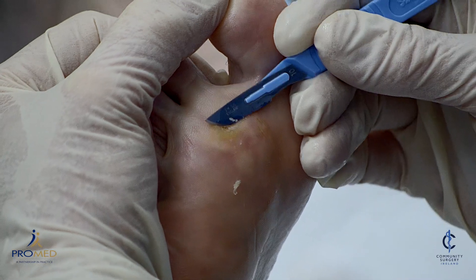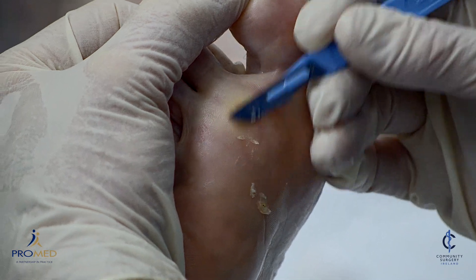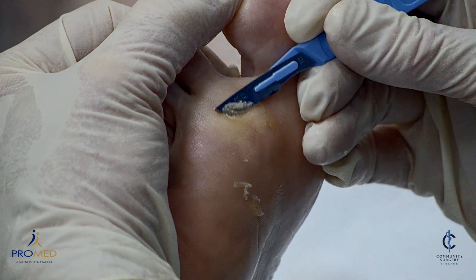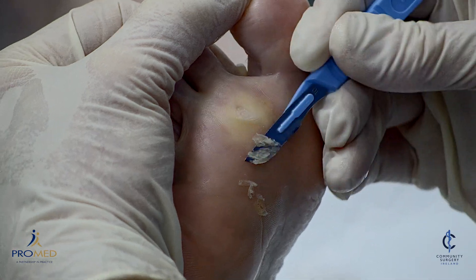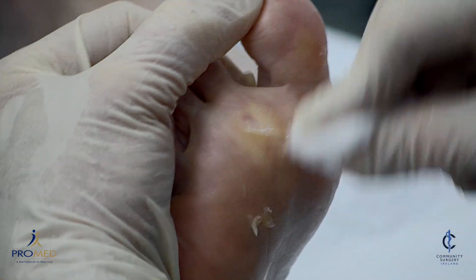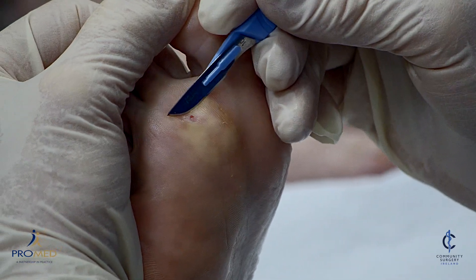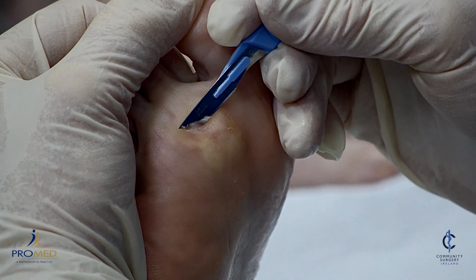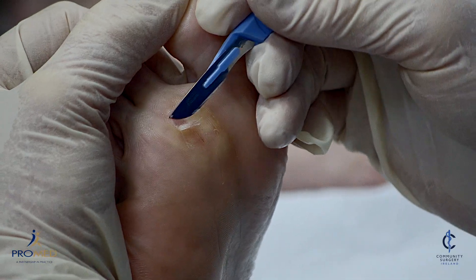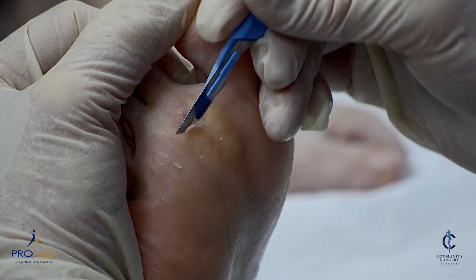So now I'm just paring down the dead skin. Is that sore, Pauline? No. Just pare down as much as possible. When you pare it down you can start to see the plantar wart or the verruca a bit more clearly. You might get a bit of bleeding. If you do, we usually control that with aluminium chloride. Starting to bleed a bit now. And there's the plantar wart — that's probably up to 75% or 80% of it removed surgically, which makes the cryosurgery a lot more successful.